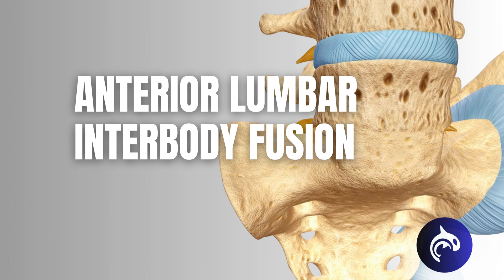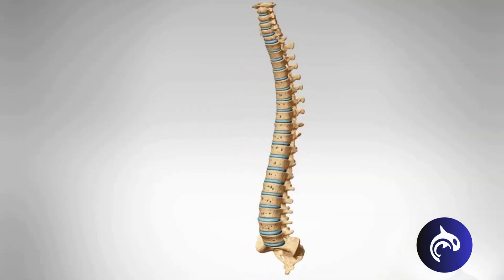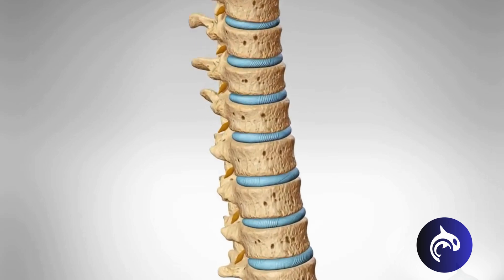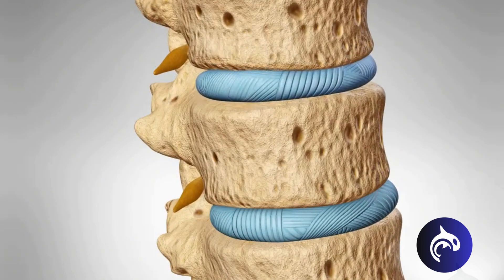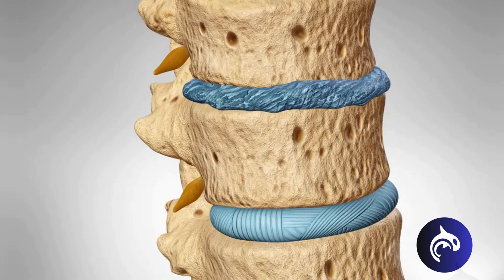An Anterior Lumbar Interbody Fusion, or ALIF, is a type of spinal fusion performed to eliminate painful movement and restore stability to the lumbar spine. An ALIF is commonly performed for a variety of spinal conditions, including degenerative disc disease, or the drying and shrinkage of discs over time.